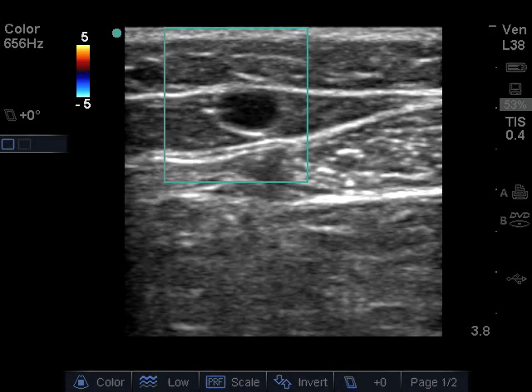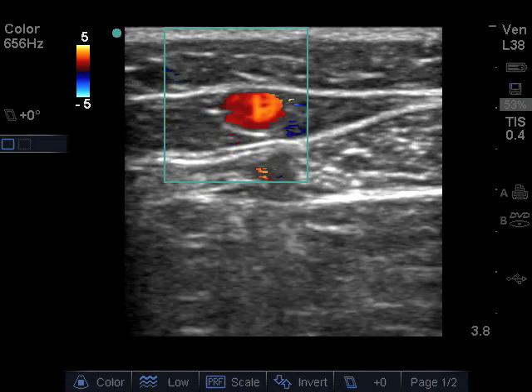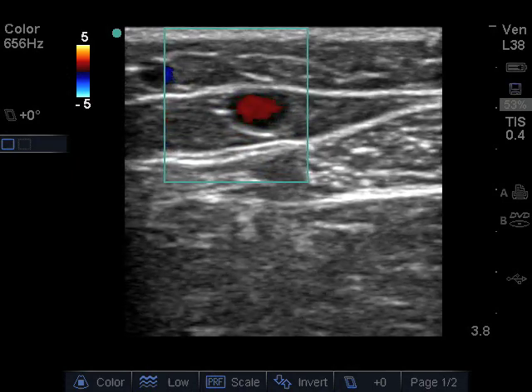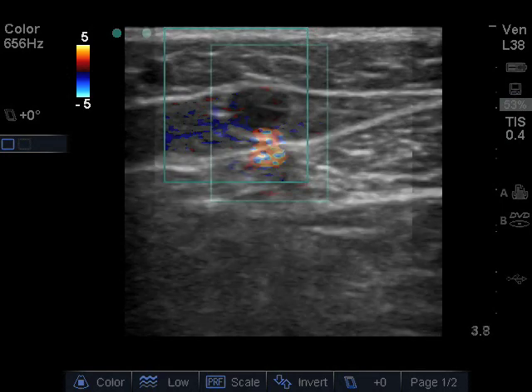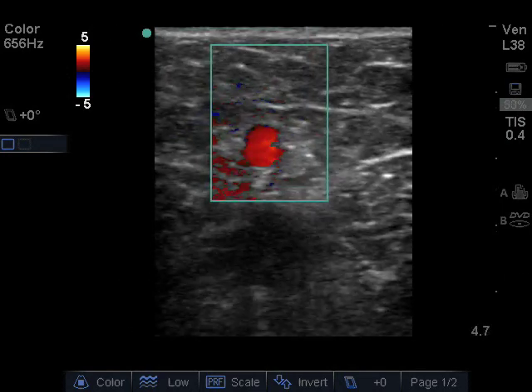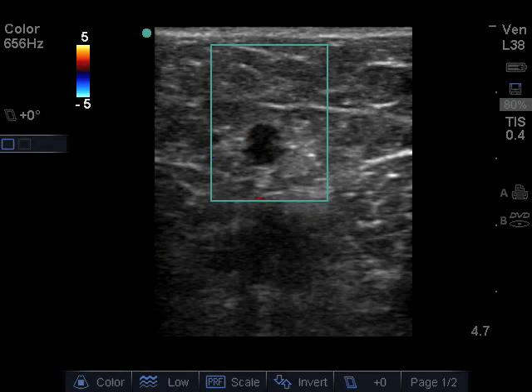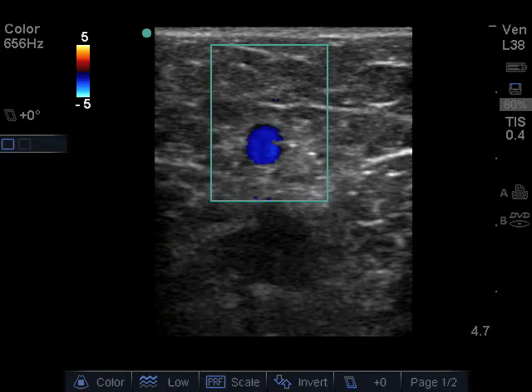Using color flow, assess for passive reflux in the vein by having the patient Valsalva. Normal passive reflux should last no longer than 0.5 seconds.